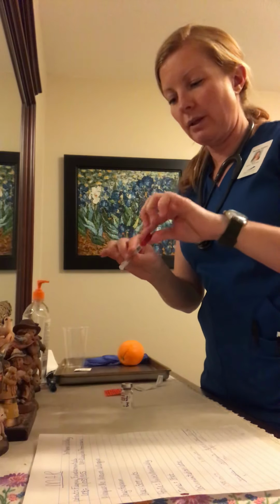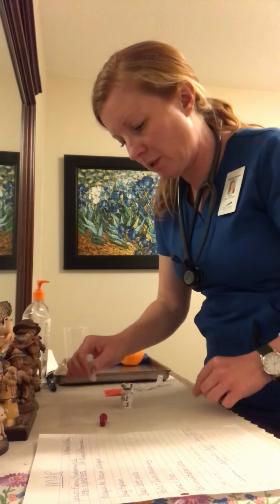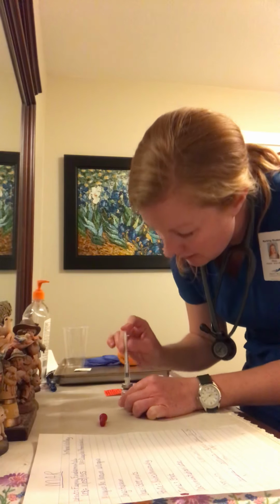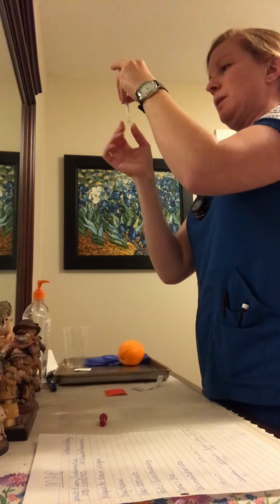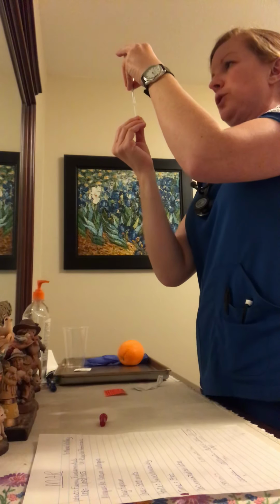So I'm going to take the lid off carefully and set it sideways so we don't contaminate. And I can also scoop it up when we're done. We are going to bullseye and insert the air. I'm going to flip this over. And we are going to get our medication without touching the plunger.